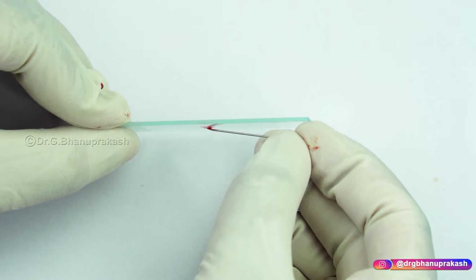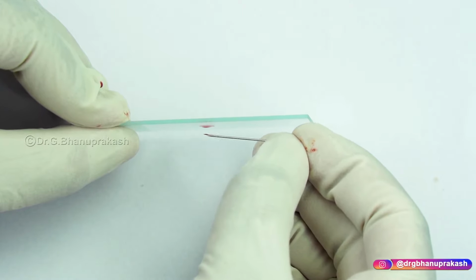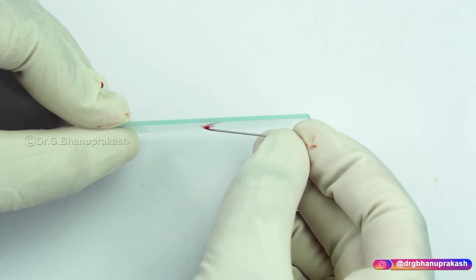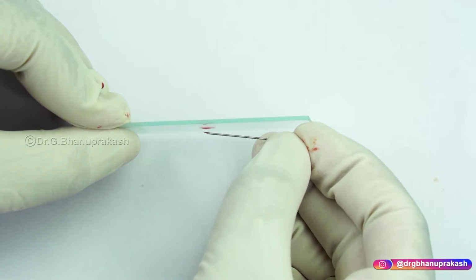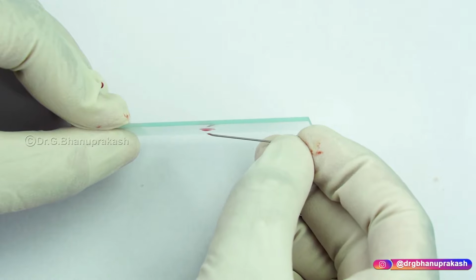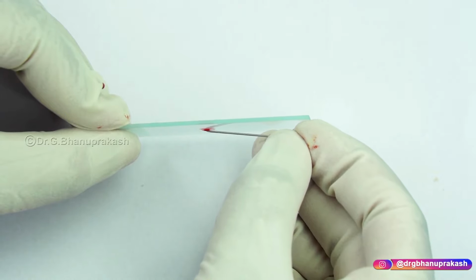You see? Slowly the blood is getting clotted and slowly the string starts appearing. Now the string appearance is not so obvious, but definitely after some time, when all the clotting factors start to act by intrinsic and extrinsic pathway, you will find the blood clot.